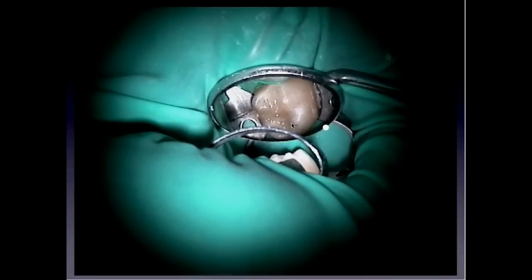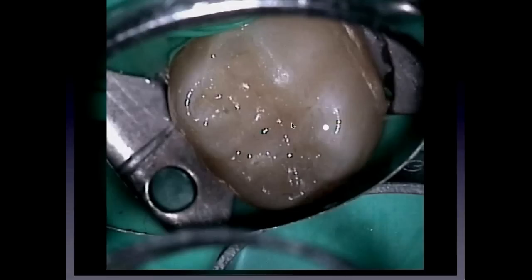Or modeling and carving fillings. I think it's very difficult to do a good filling because you have the same color of tooth and filling material of the composite, so that the three-dimensional form of a filling is not easy to see without any loupes or microscope. And here I'm using my microscope every time. I prefer it much more than the loupe because I can sit straight and look straight ahead through the microscope, and so I can save my back for many years without pain.